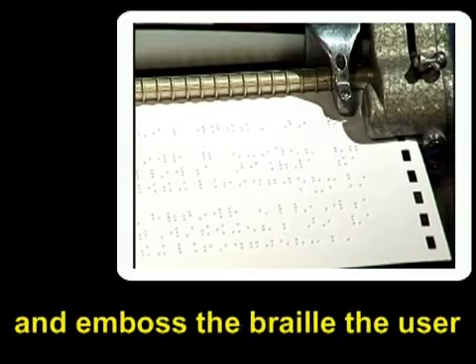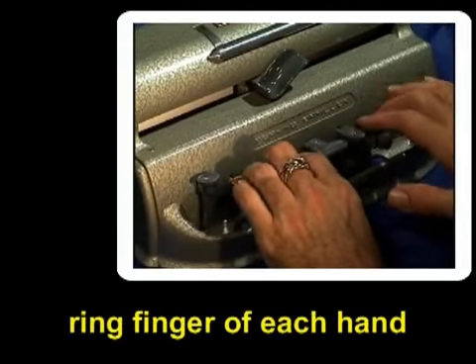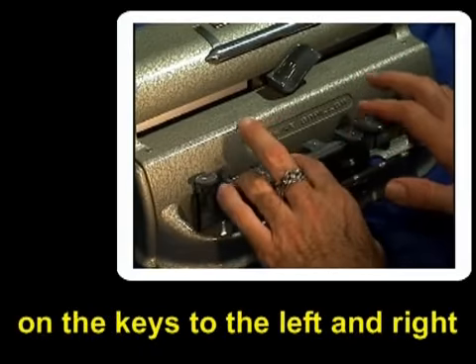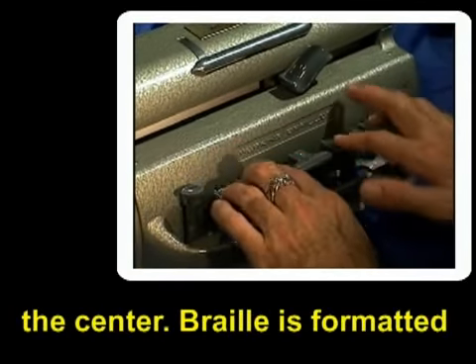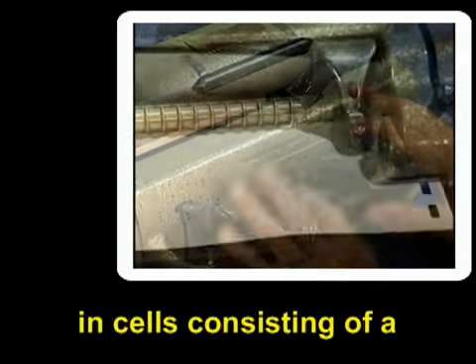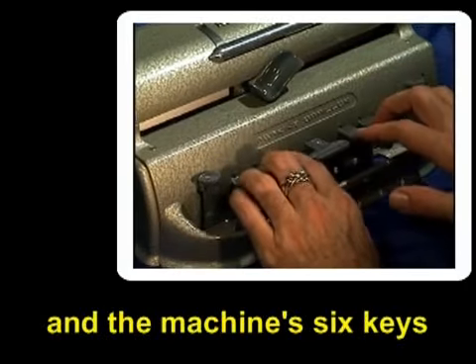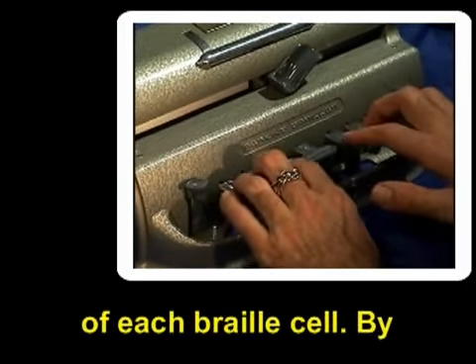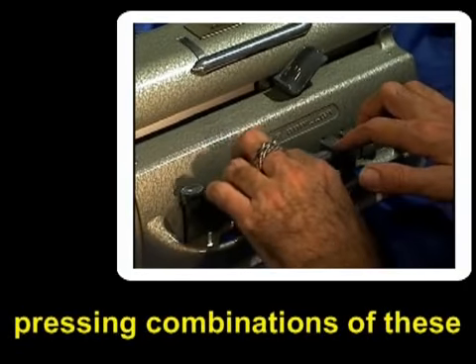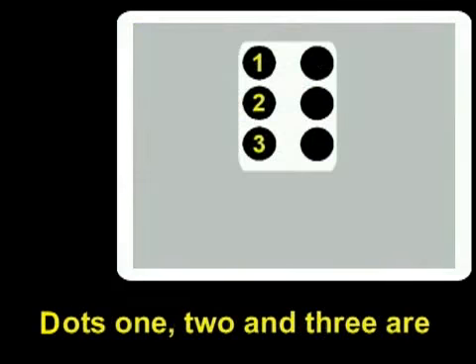In order to write and emboss the Braille, the user places the index, middle, and ring finger of each hand on the keys to the left and right of the space bar located in the center. Braille is formatted in cells consisting of a combination of one to six dots, and the machine's six keys correspond to the six dots of each Braille cell. By pressing combinations of these keys, users produce letters, numbers, and punctuation marks.